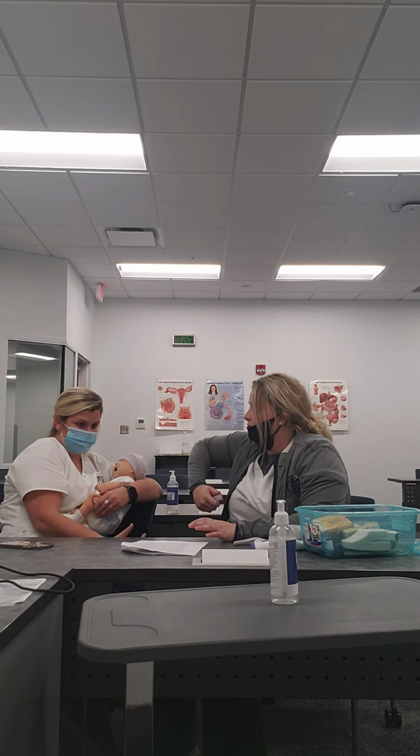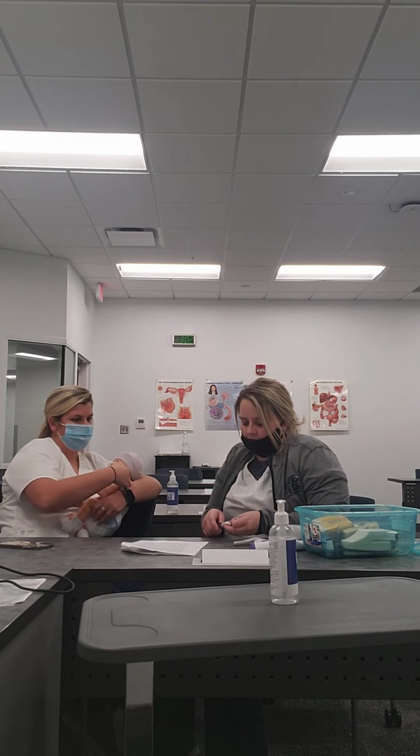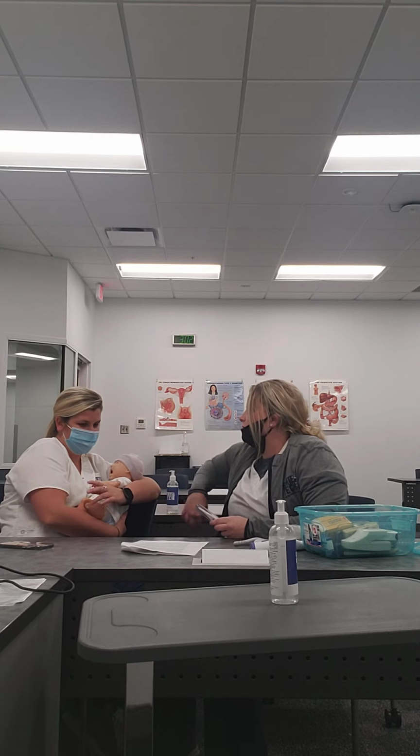Okay. So now we have the armpit. That's just right under the arm. So you can use the same thermometer, the digital thermometer. When you place the thermometer under the child's armpit, make sure that it touches skin. A lot of people struggle with, hold on, this is going off. Just putting it in between the clothes. Yep, and you don't get the accurate skin reading.